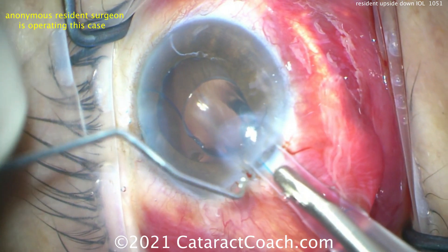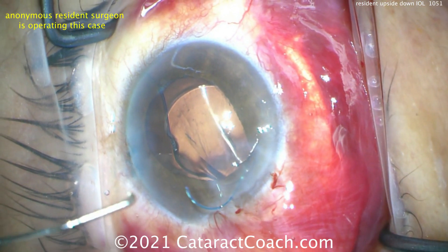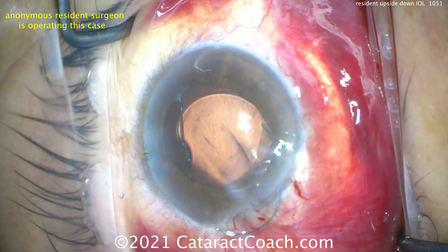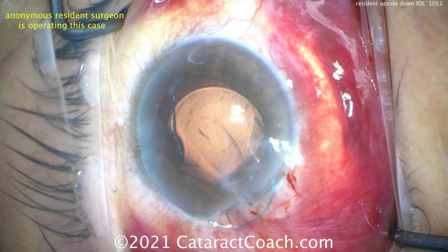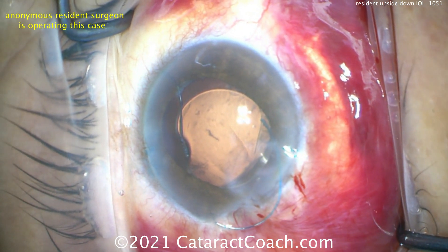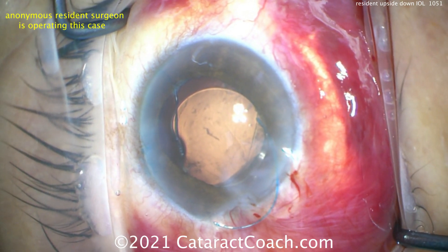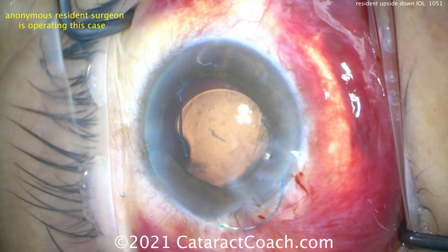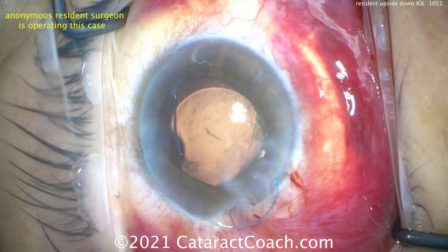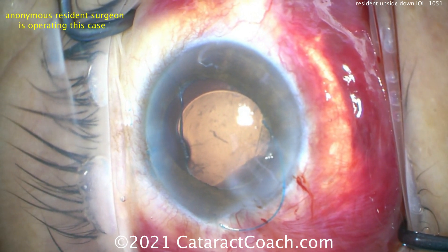Now look — that leading haptic is in the S formation. What are you going to do? The lens is basically in the eye upside down. You can see that S formation; you can't leave it like this. This three-piece lens is angulated — the haptics have a five or ten degree angulation to the optic. If you leave it in the eye upside down, the IOL will sit too close to the back surface of the iris, and you can actually cause a pupillary block syndrome.